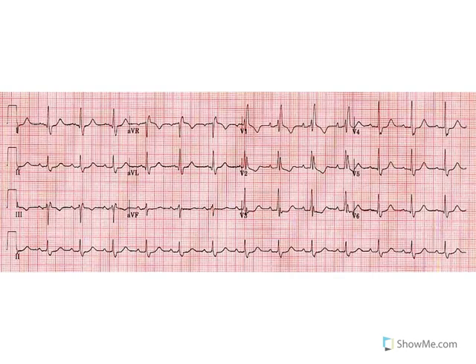Well, let's look at a right bundle branch block, okay? Very first thing I do, I look and I see, yep, there's P waves. There they are. No problems there. I'm seeing plenty of them. You can find them anywhere on here. Those are all P waves. Great to see, okay? Well, I've got P waves, and then I've got this weird sort of wide complex.